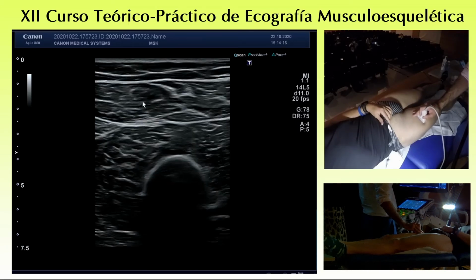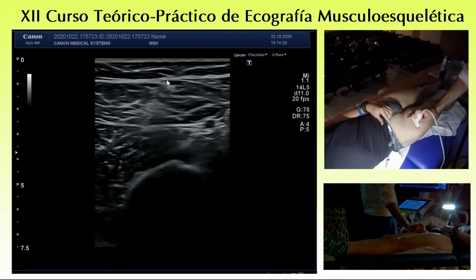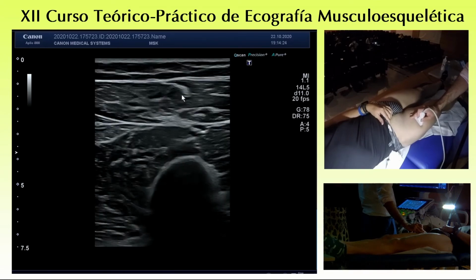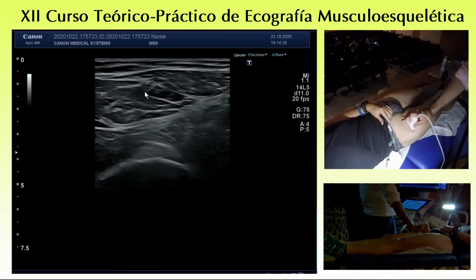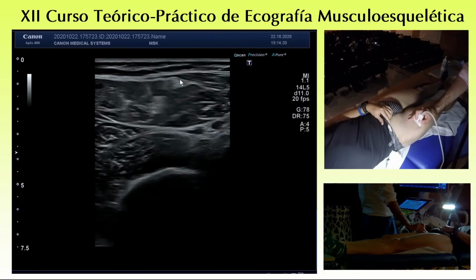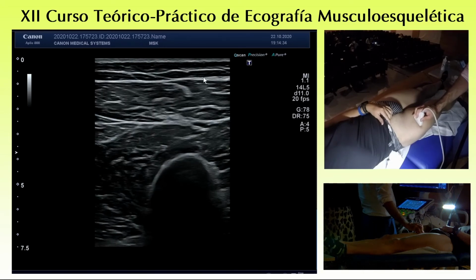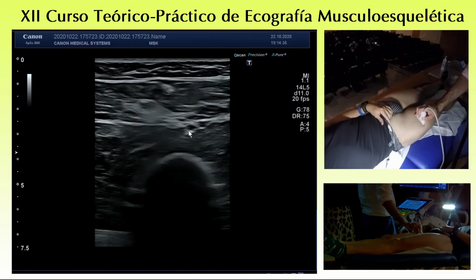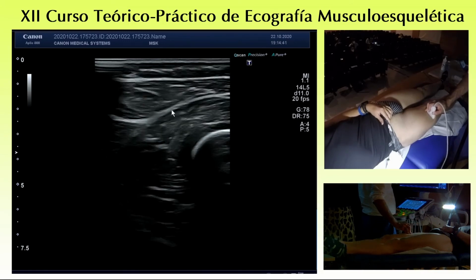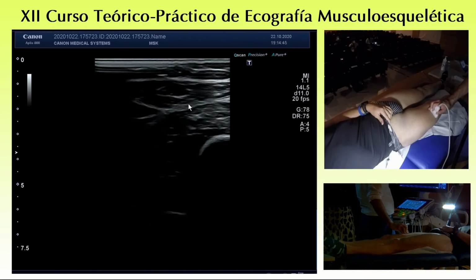So it's quite a complex muscle. For the indirect part, the indirect bundle of the muscle, the myotendinous junction is around the central aponeurosis. For the direct part, the myotendinous junction could be much more superficial, and for the distal part, we have a myotendinous junction in common with the vastus intermedius, in this component.